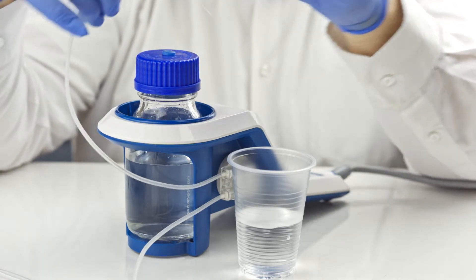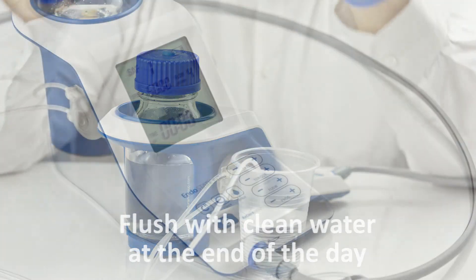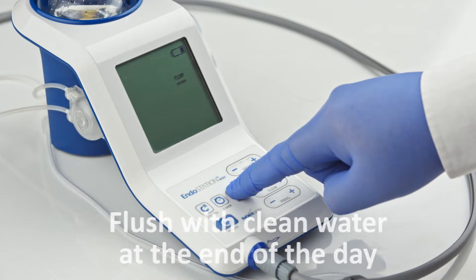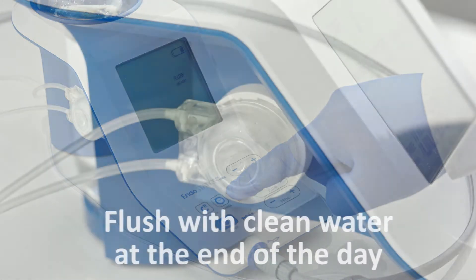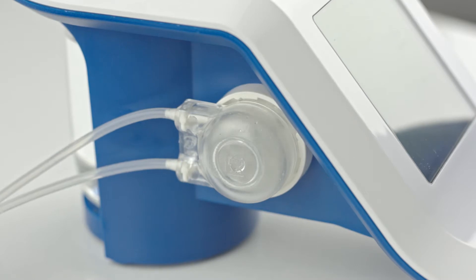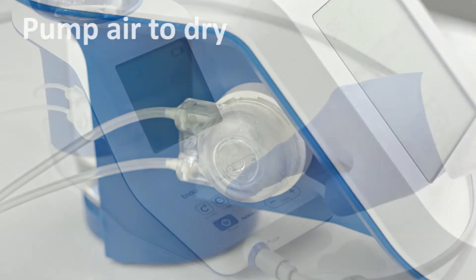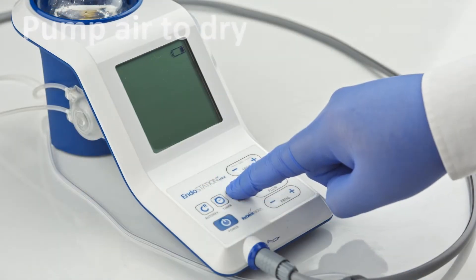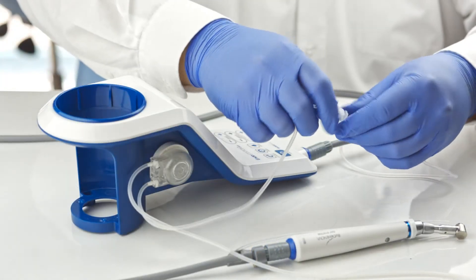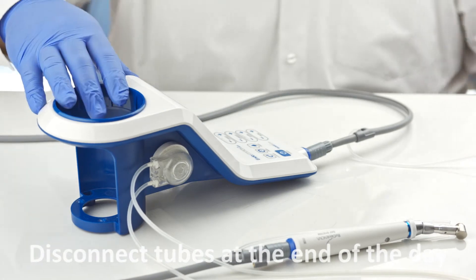Endodontic irrigants may form crystals and clog the tubes. To prevent this, replace the irrigant with clean water and run the pump on maximum output at the end of each working day, using the rinse button for at least 30 seconds. Pumping air into the irrigation line in order to drain the excess water after flushing is also advised. The irrigation bottle should be cleaned periodically. Disconnect the irrigation line tubes from the device at the end of each working day.